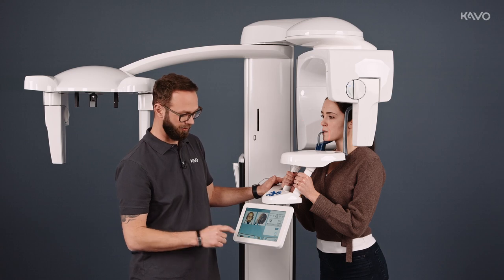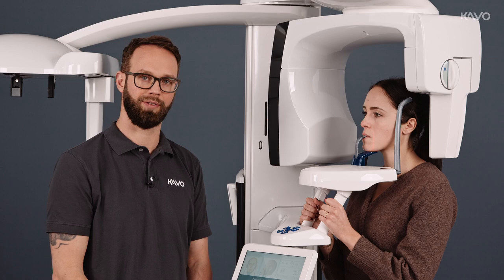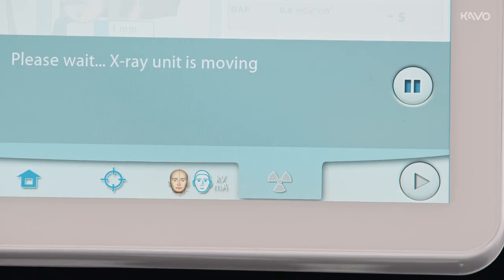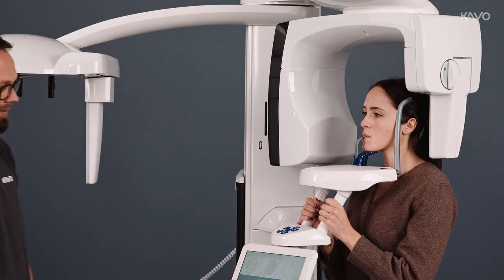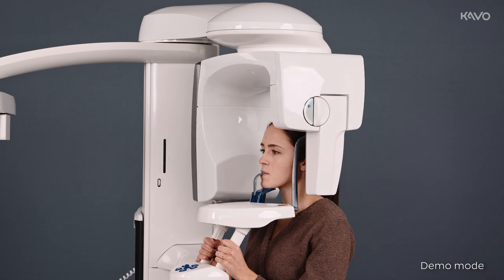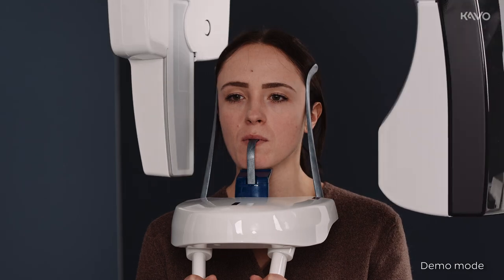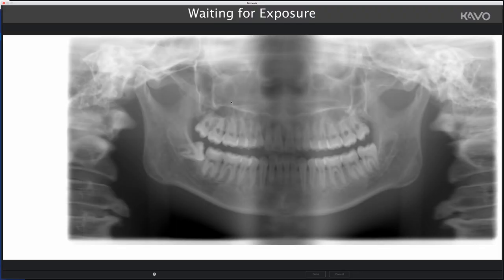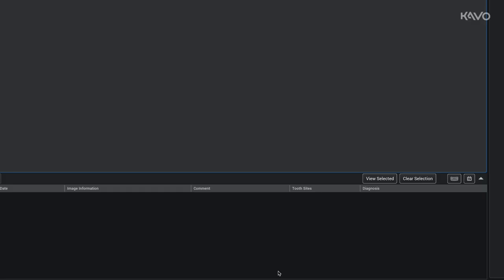Once the patient is in the right position, we go to the final step: triggering the imaging. We can only do this when the green light stops flashing and goes a steady green. We then leave the X-ray room and trigger the imaging, keeping our finger on the trigger button. After the imaging, we go into Romexis and click Done to save the image.